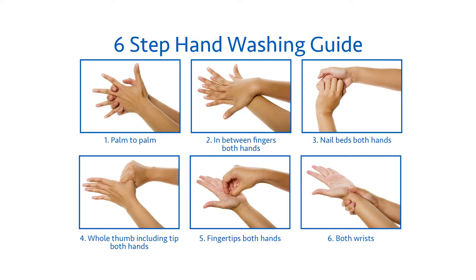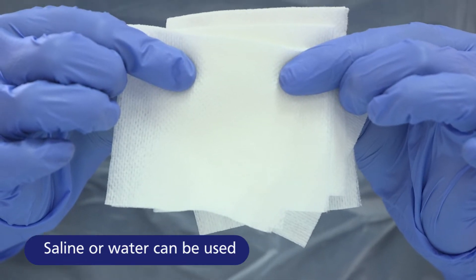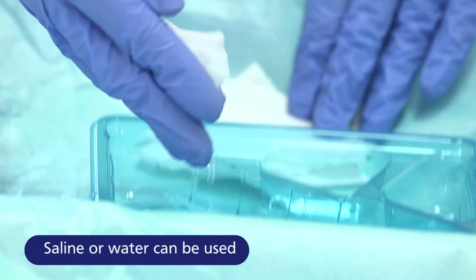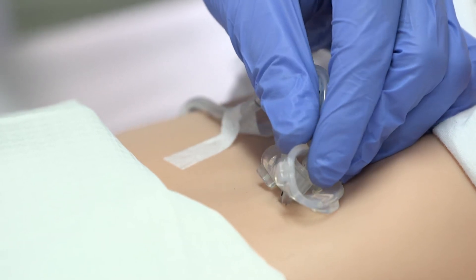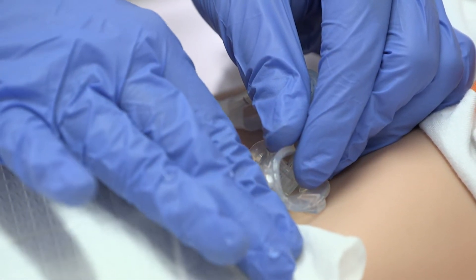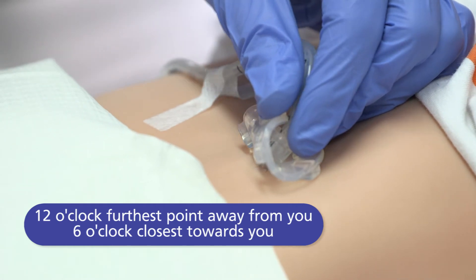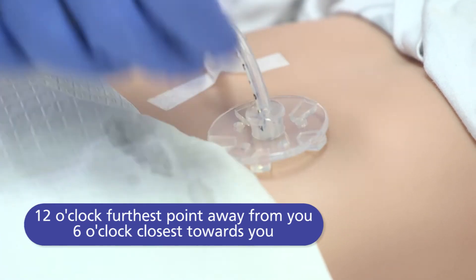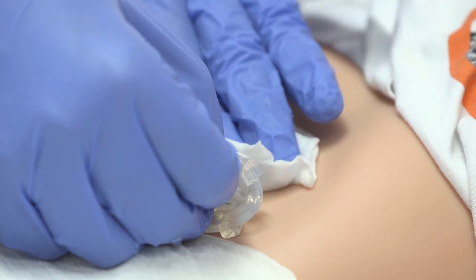To clean the gastrostomy you will need to wash your hands, prepare a clean area and set up your equipment. You will need some saline, gauze and a pot for the water. Wet some gauze and squeeze the excess water, using your thumb on the opposite hand to support the disc. Wipe in a circular clockwise motion as close to the stoma as possible. Gently wipe from 12 o'clock to 6 o'clock in one sweep and repeat from 6 o'clock to 12 o'clock with a fresh piece of gauze. This pattern will need to be repeated until clean. A cotton tip swab may be used for hard to reach areas.